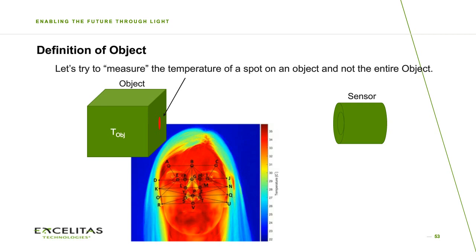Why do the temperature readings decrease as we move away from the sensors? Even smaller field of view sensors also have decreased with the distance. This is, once again, the distance dependence through stray light, because the further you go away, the more you see actually going from the sides of the object, which are also partially reflected from the inside of the sensor.